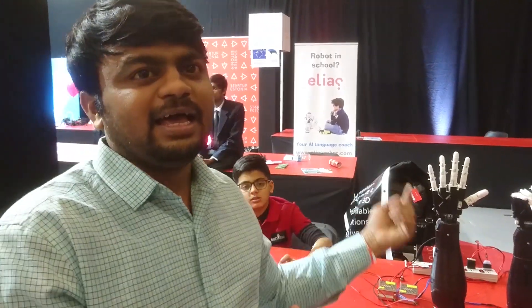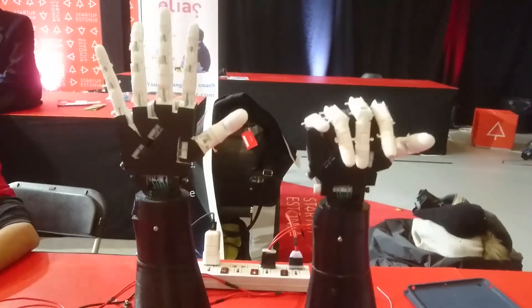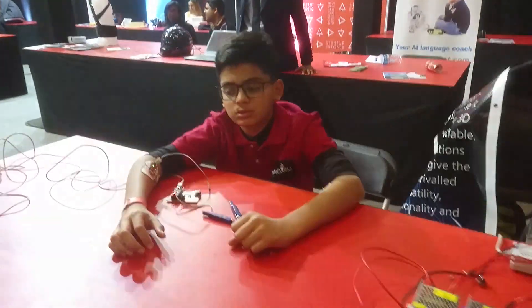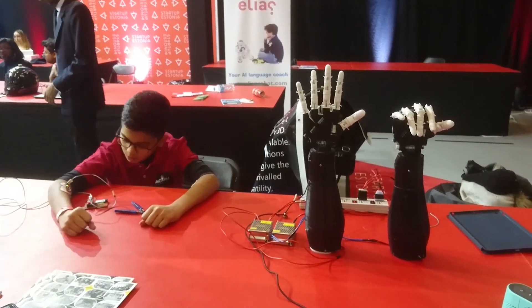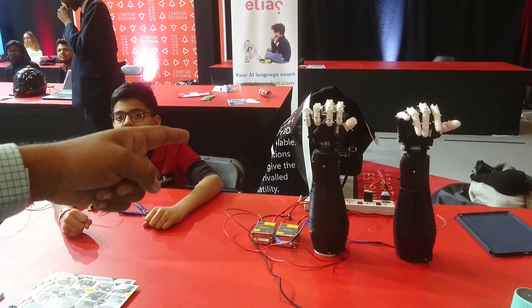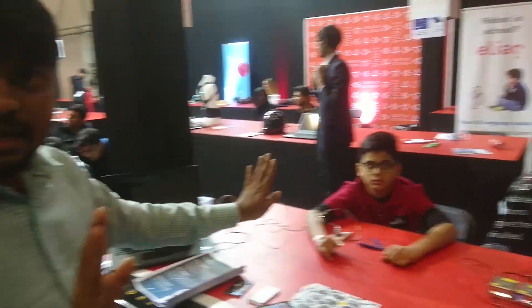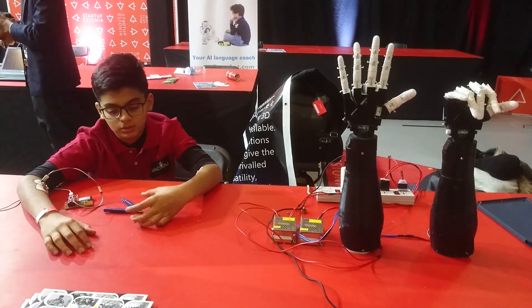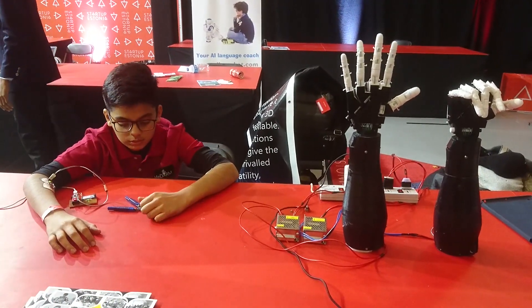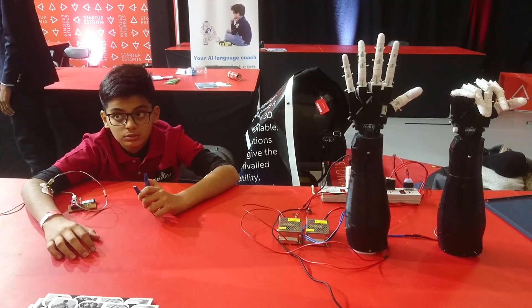You will feel it is like a real hand. See the demonstration — at present it's open, and here the system is also open. Now close it — it's going to close. Now I'm not allowing him to close his palm physically; I'm just telling him to close it by thinking.